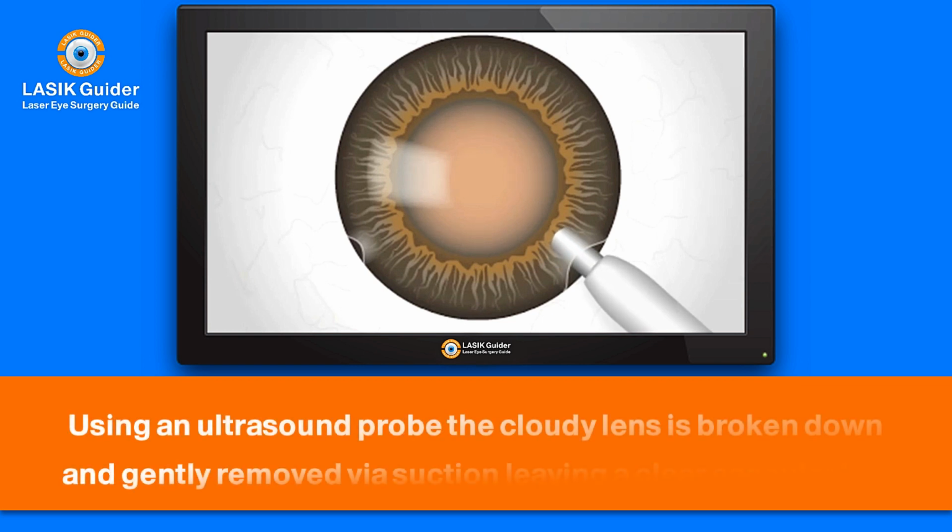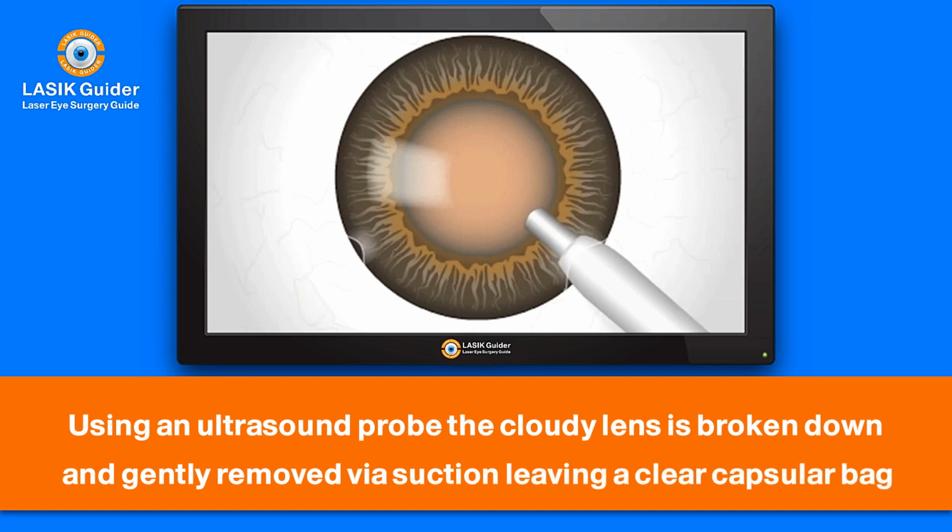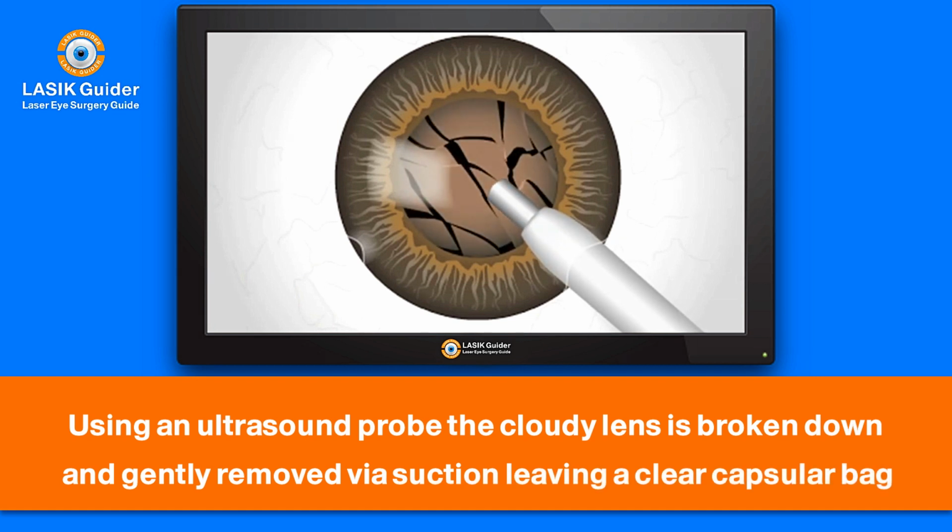Using an ultrasound probe, the cloudy lens is broken down and gently removed via suction, leaving a clear capsular bag.